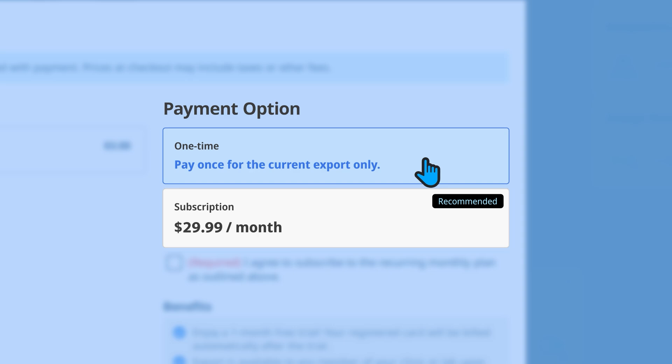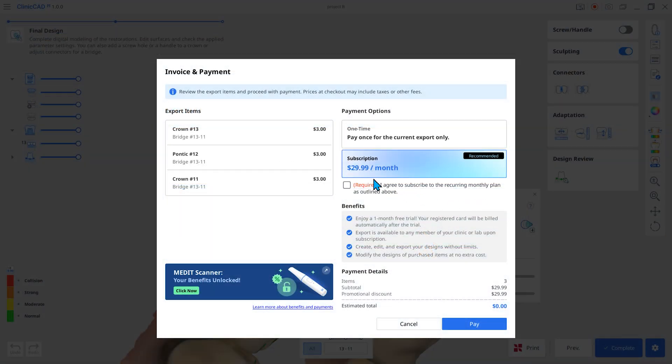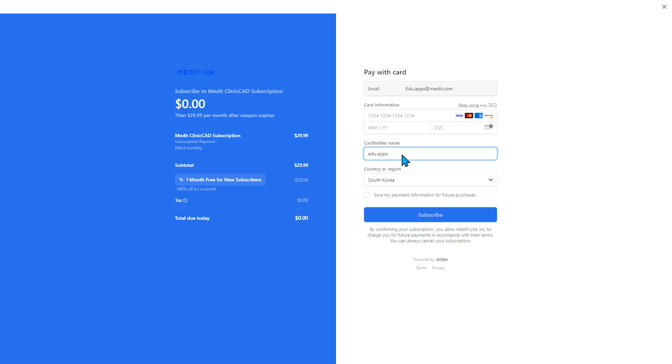Option one: subscription. With a subscription, you can extract unlimited design files during the subscription period. Pay with an admin account at the design extraction stage.